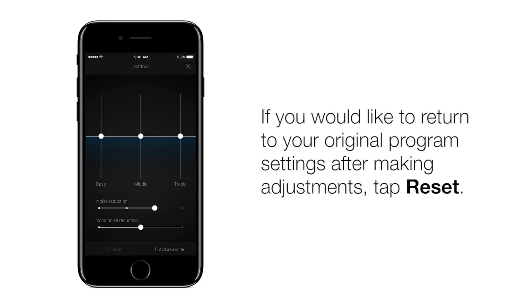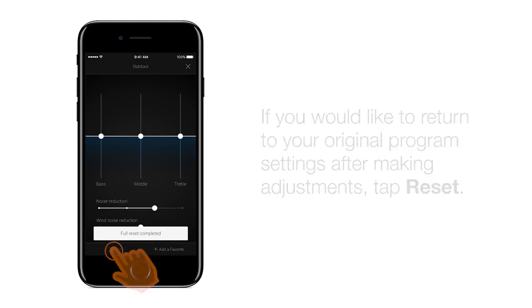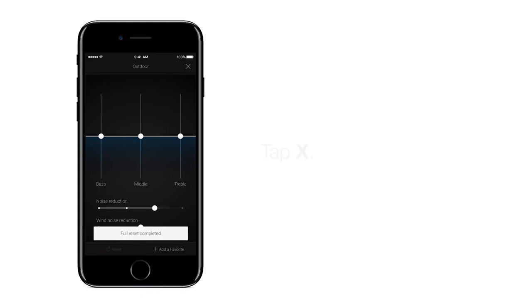If you would like to return to your original program settings after making adjustments, tap Reset in the bottom left corner. A window pops up that reads: Full Reset Completed.